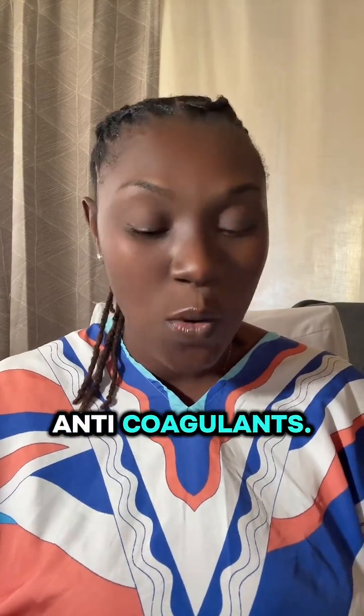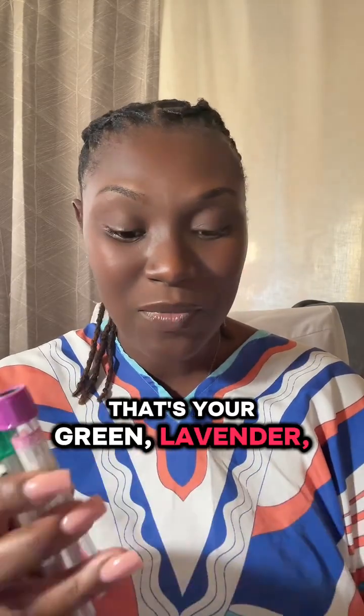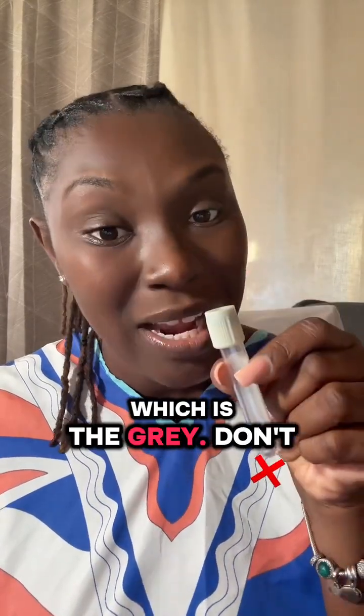Then we have our anticoagulants. That's your green, lavender, pink, and the royal blue. And finally, you have your glucose, which is the gray.